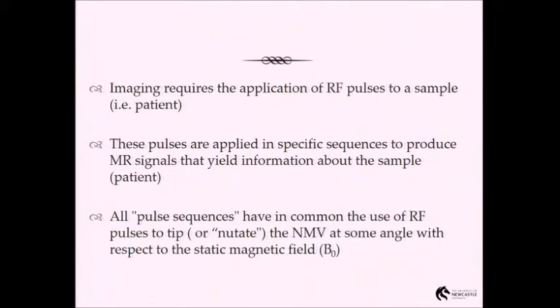That's why motion is probably the biggest enemy in MR. So when we talk about trying to do MR on people that are claustrophobic or kids, we talk about either giving them sedation to help them stay still, or in the case of kids, giving them a general anaesthetic, because motion is really what will kill your images. You can do some breath hold techniques, you can make it pretty short, but if a patient is really non-cooperative and wriggling all over the place, it's just not going to work.